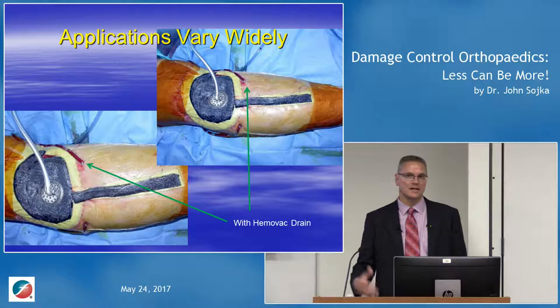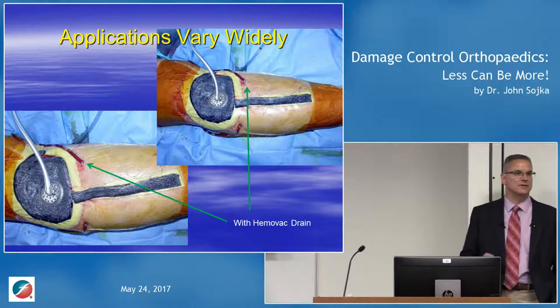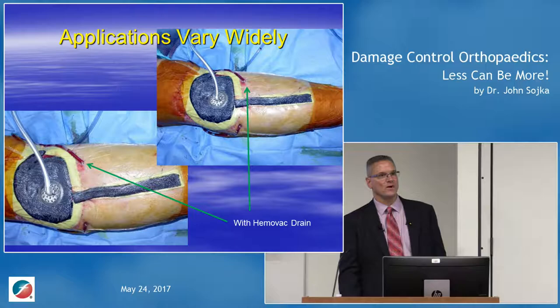Is that black foam or white foam, or what's on your periphery? I line the outside of my wounds with Xeroform so that they don't get macerated otherwise. That tissue gets real wet and weepy.